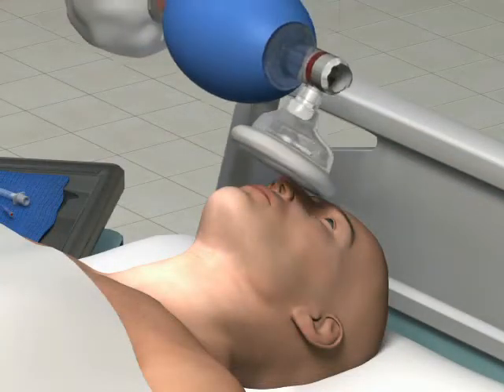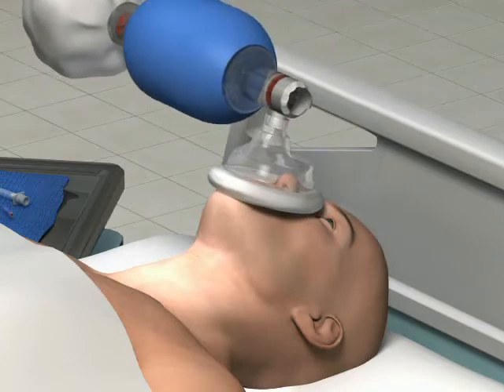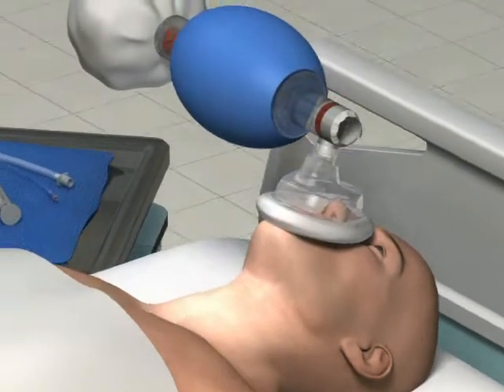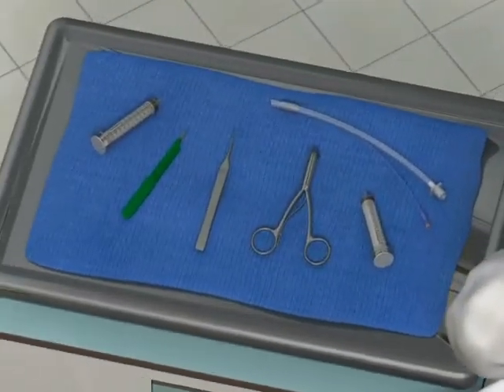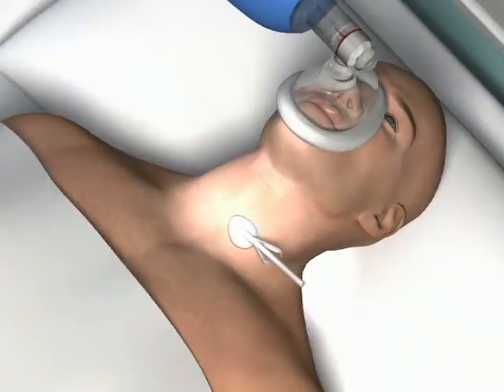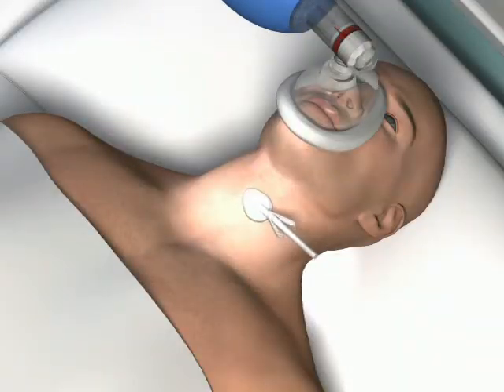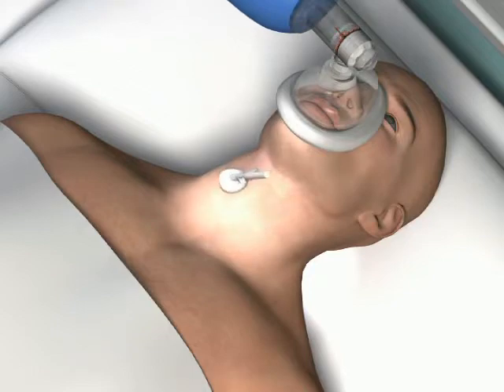Initiate bag valve mask ventilations and make sure that the necessary equipment is available on a bedside tray. Prepare the anterior neck with a skin cleansing agent, such as chlorhexidine or povidone iodine.